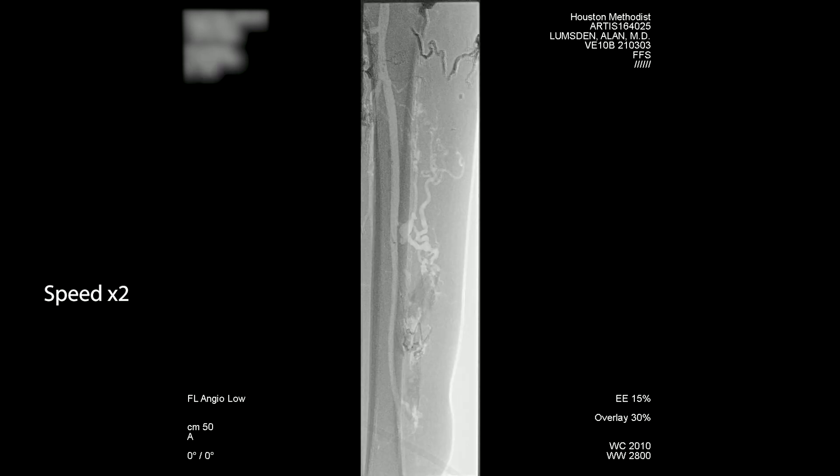Now you can see the onyx in the form of the cast of the vessel. You kind of want to get that microcatheter as far out, distal into the malformation as you can, then start the injection and gradually pull it back. If the patient had this and didn't have any symptoms, we probably wouldn't do anything. Many malformations are stable, though trauma, pregnancy, or contraceptives have been reported to actually increase the growth of these malformations.